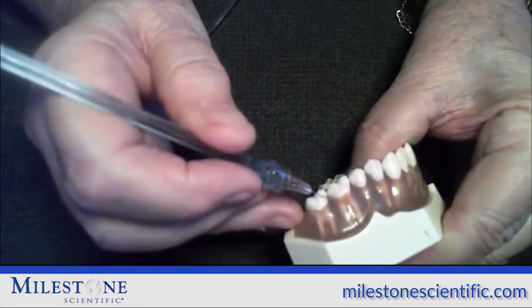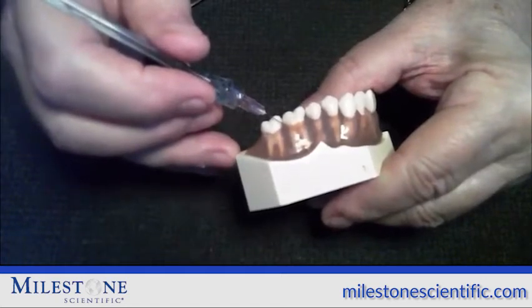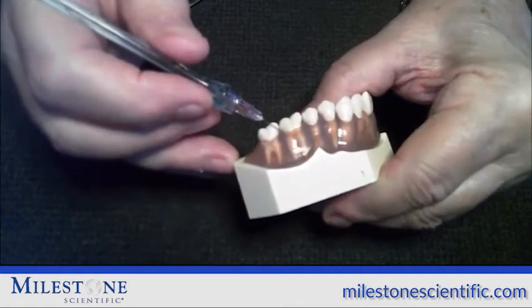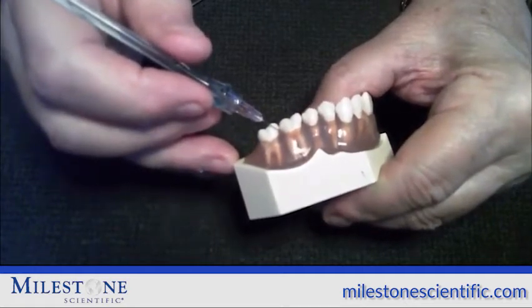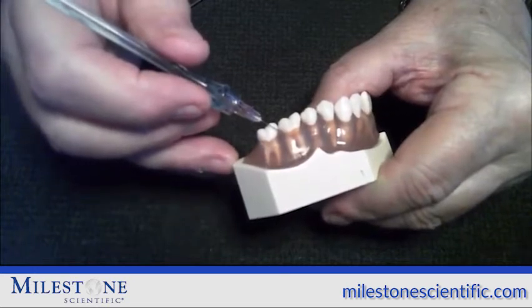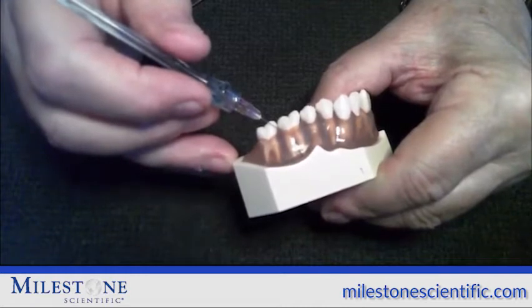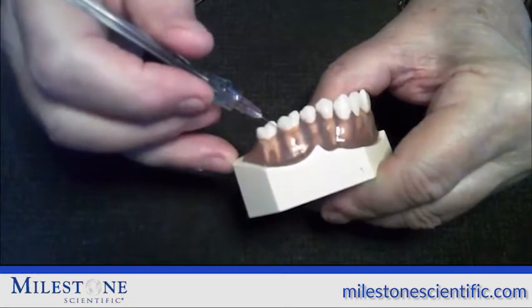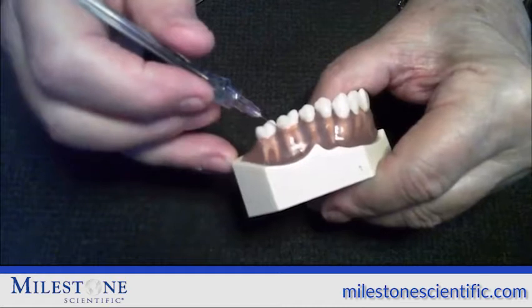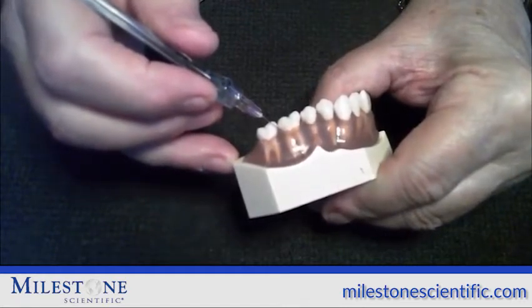At that point, you stop and wait about 10 to 15 seconds until the DPS lights and sounds begin to start. When we hear any of the sounds, we stop and hold the needle in place. How much of the anesthetic we deliver depends on the tooth that we're working on and the drug that we're using. If you use lidocaine, you would put half a cartridge on the distal, and then when you're ready to remove the needle from the tissue, you hit the foot pedal and go into aspiration.